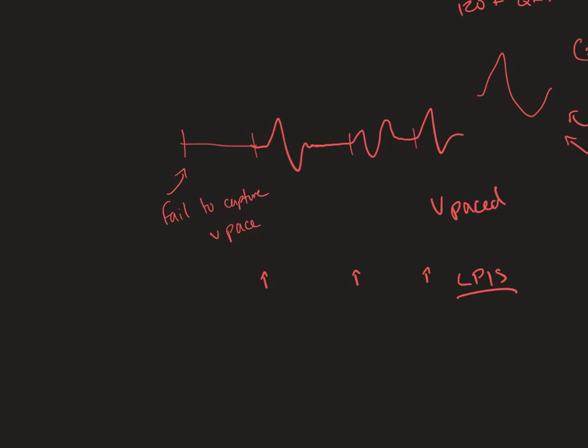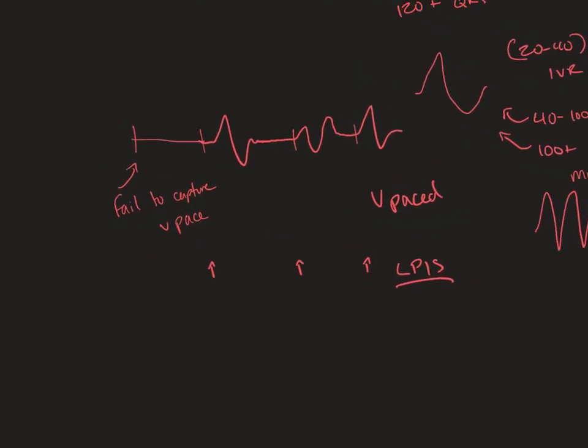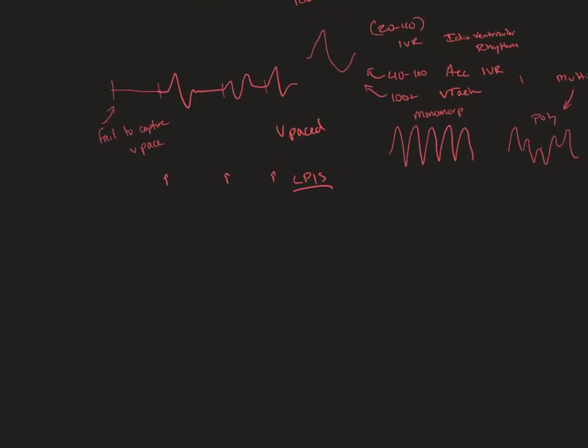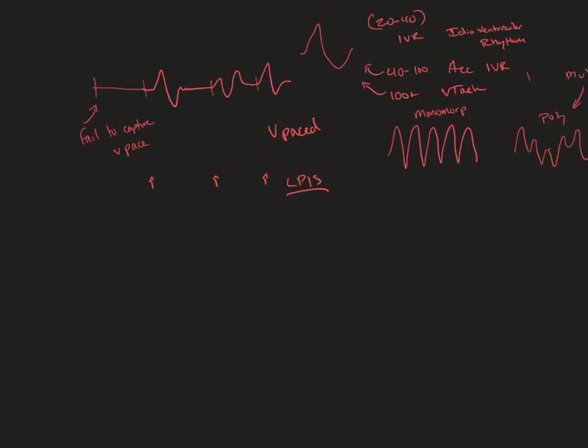So theoretically you would say, we have a ventricular paced rhythm at 60 beats per minute with one failure to capture on the rhythm. It's not rocket science. If you see a pacer and it's not capturing, it's a failure to capture. If you see a pacer and it is only making ugly ventricular beats, it's a ventricular pacer.